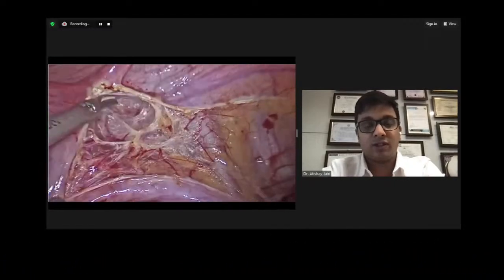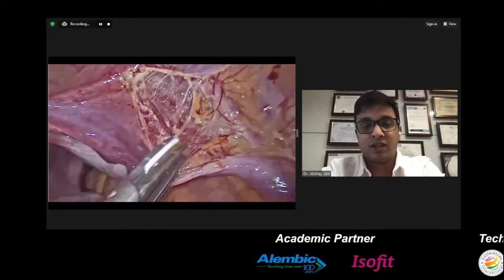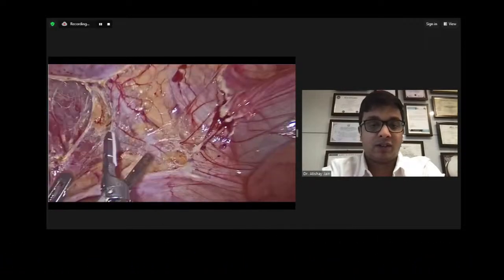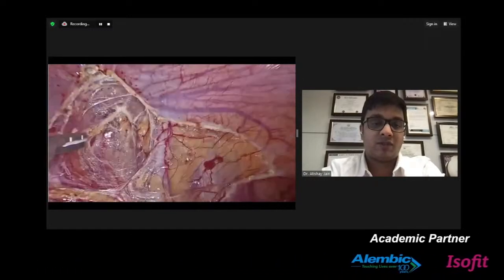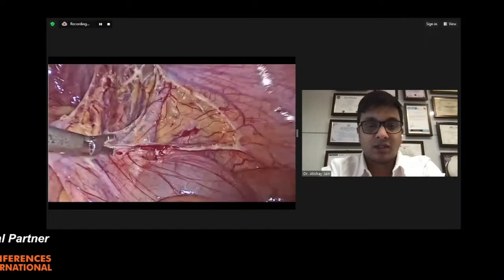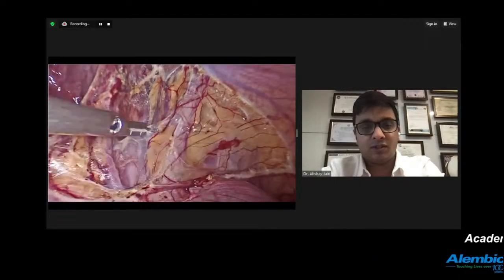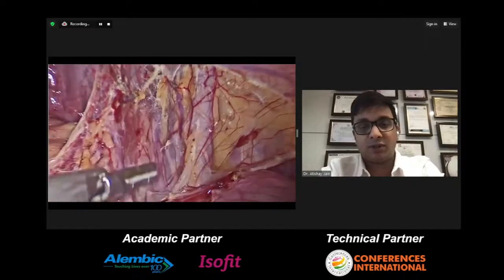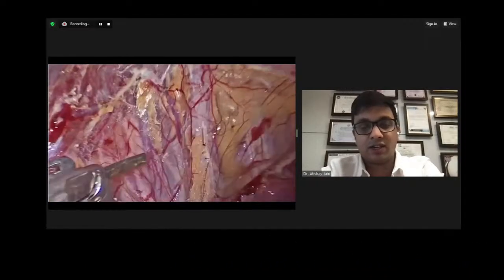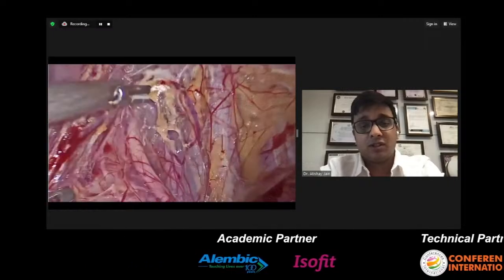In this case, we were doing a conservative surgery, so we just let the round ligament be, and we need to go layer by layer, and we don't need to fight with the tissues. We need to just separate them and cut them when you find some difficulty. And here, the first structure that we should see is the ureter, and we can identify the ureter with its peculiar vascularity and the peristalsis.